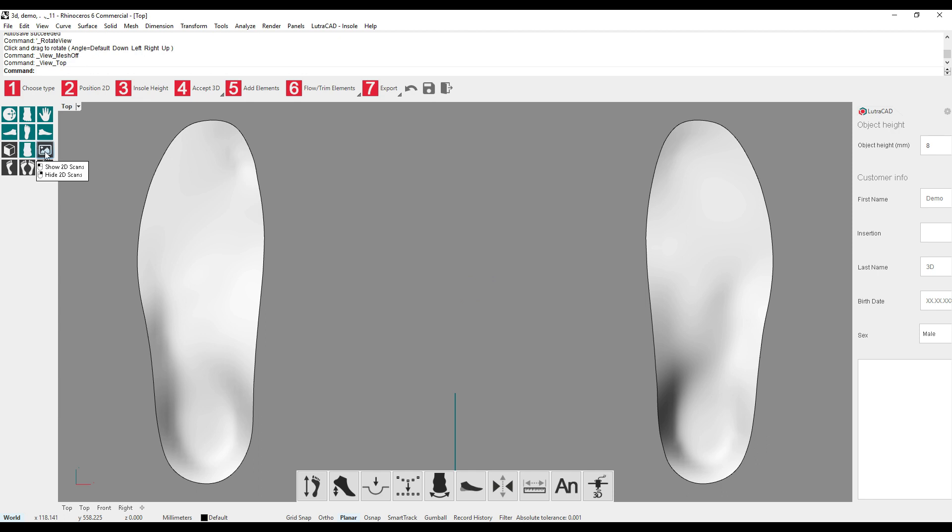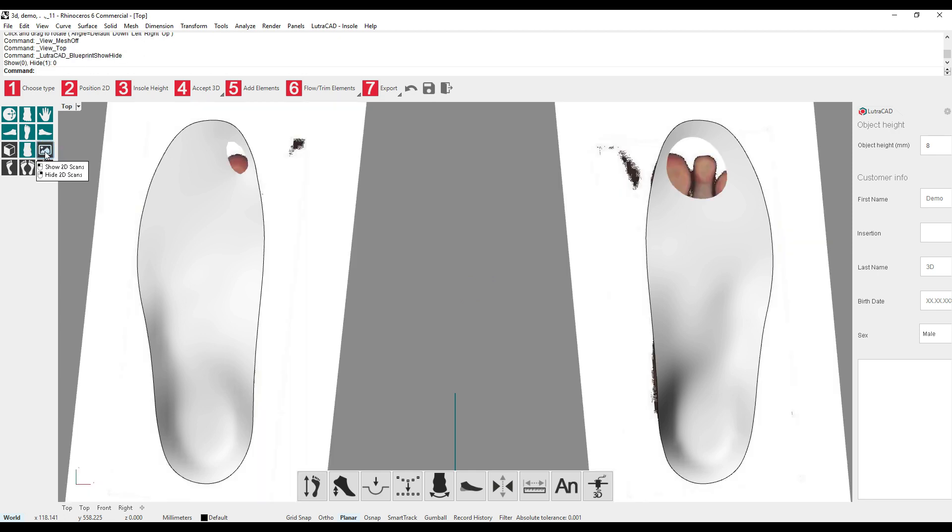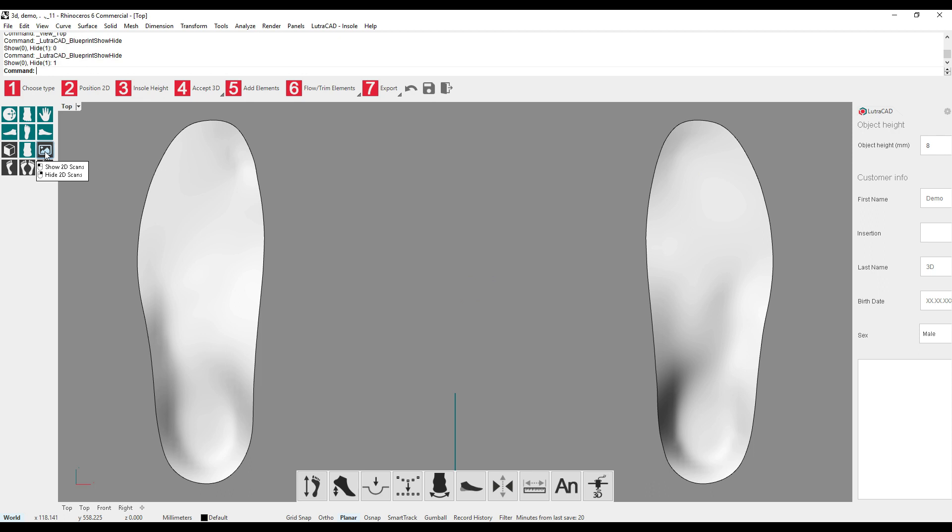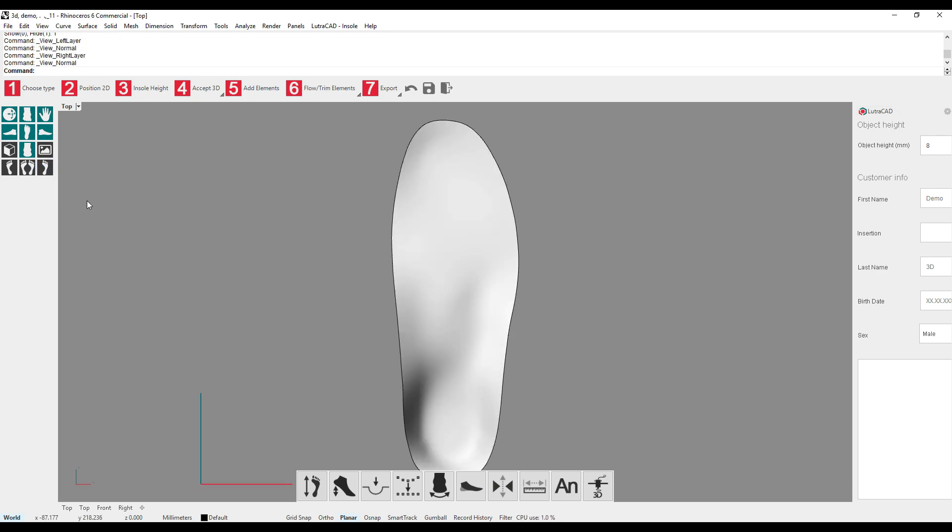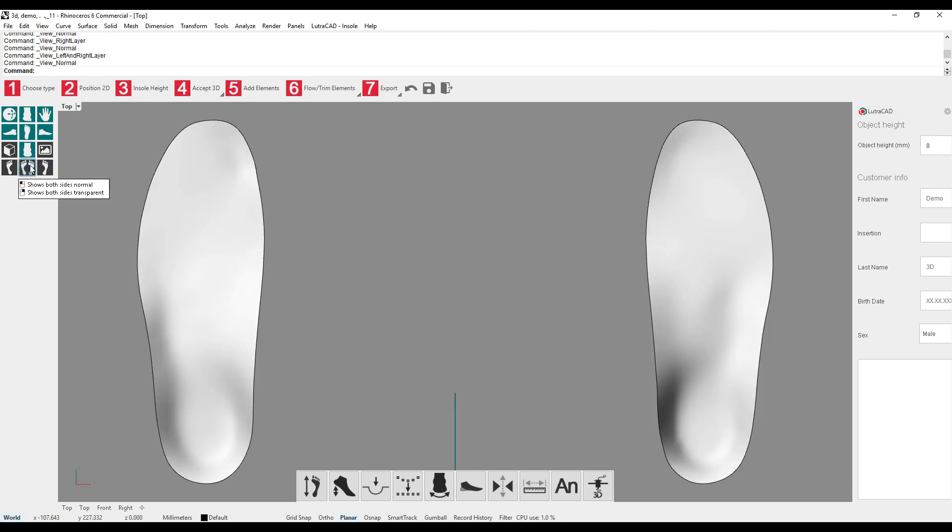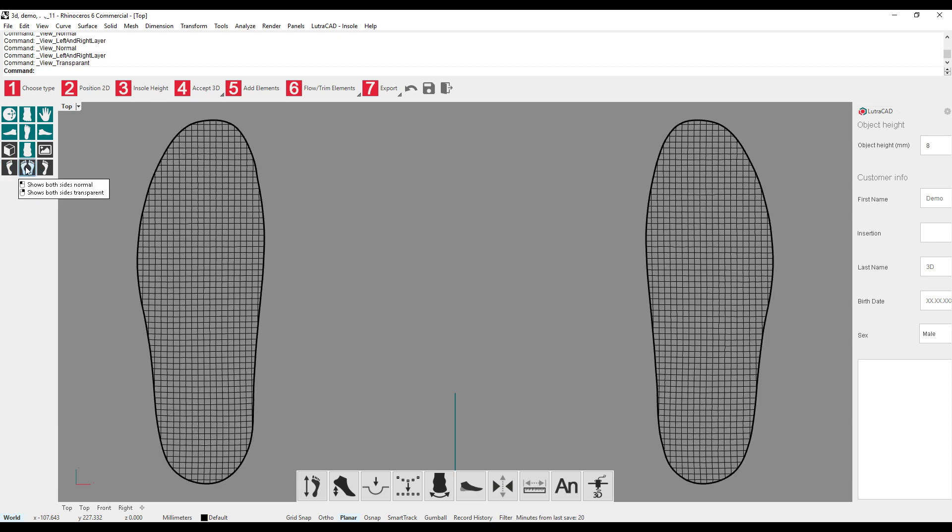The same goes for 2D scans. Left mouse button to show and right mouse button to hide. The last three buttons are for showing the left, the right, or both insoles. By using the right mouse button, we can go into transparent view, and by using the left mouse button, we can go into normal view.